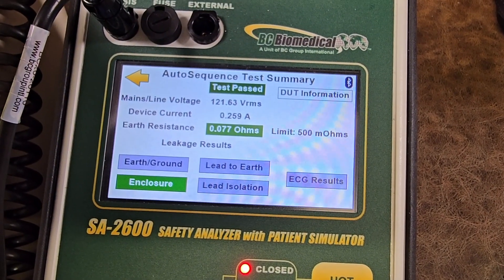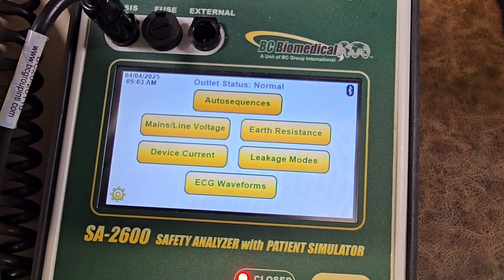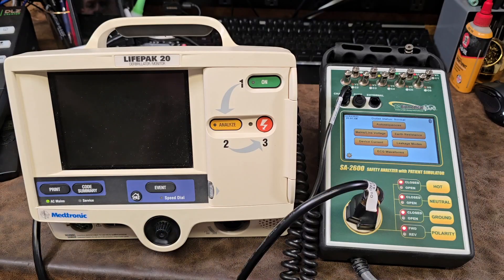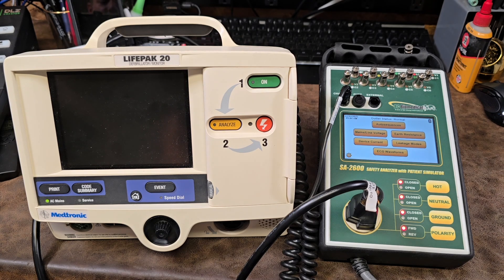This device is good to go. Press the yellow arrow and you're back at the main screen ready to test your next device. So folks, that's it with the SA2600 — easy to use, very user friendly, very customizable.